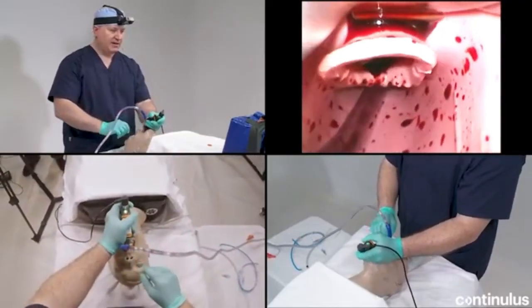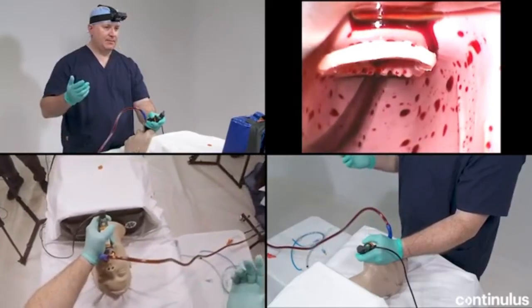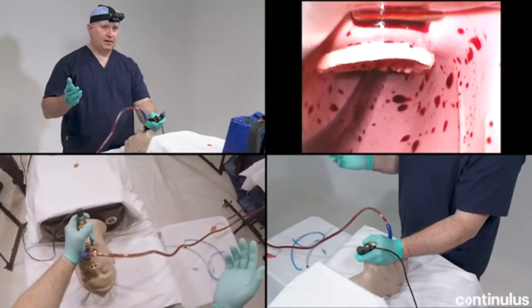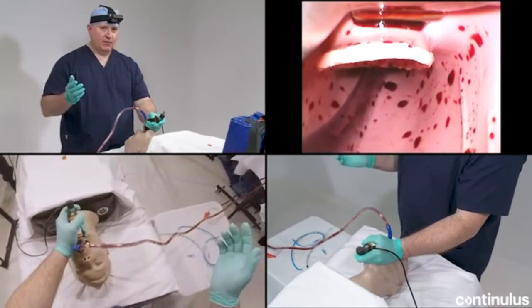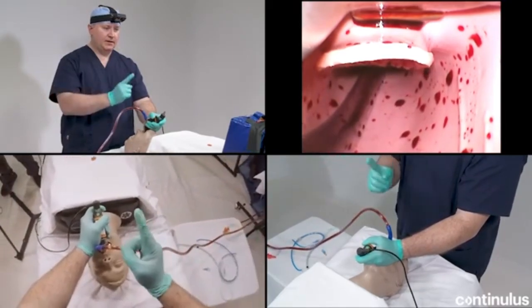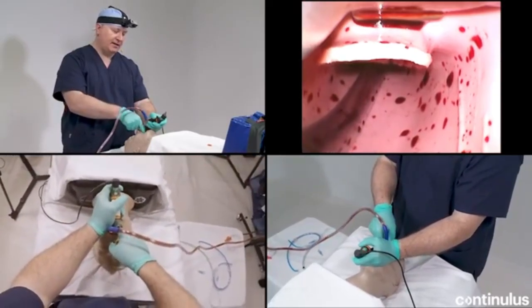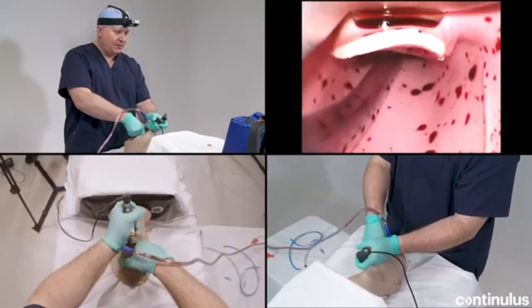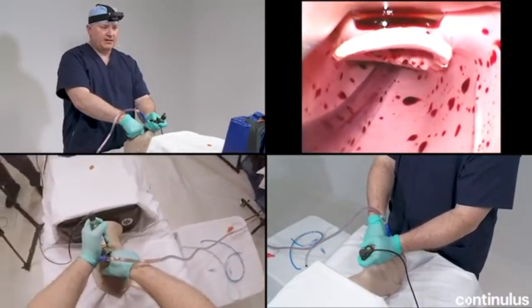So James, give me 3 pumps on the handle. And as you can see, what's happening now is that my suction catheter is taking up the lion's share of the airway contaminant. My next maneuver to create room for tracheal tube delivery, I've called the salad poke. With a single index finger, I can change the course of airway management. I simply place it into the pharynx alongside the right margin of the laryngoscope blade, and what I'm doing essentially is a dilatation maneuver.